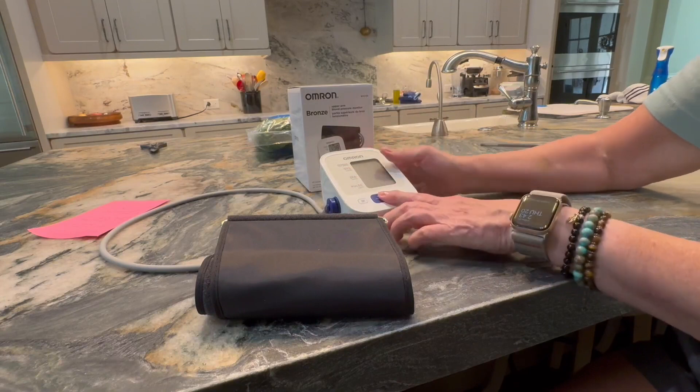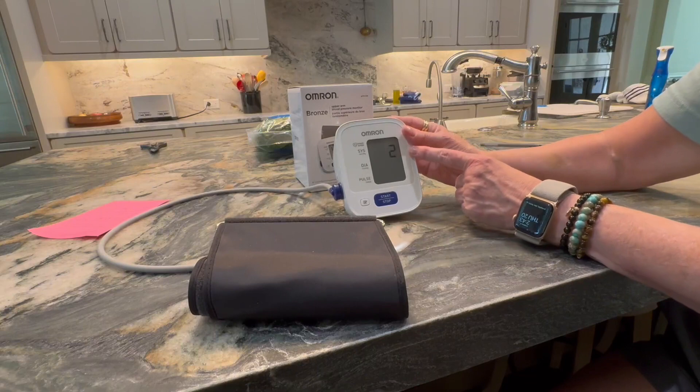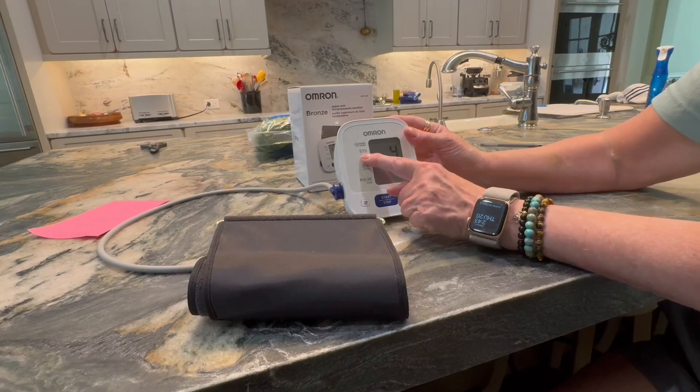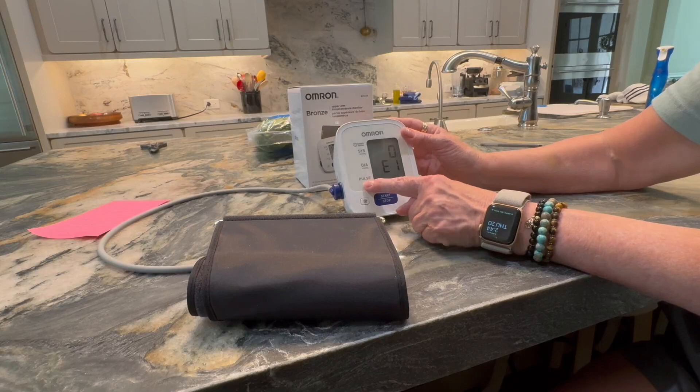It has very big numbers on it as you will see right here. This is your systolic number, this is your diastolic number, and this is your pulse number down here.